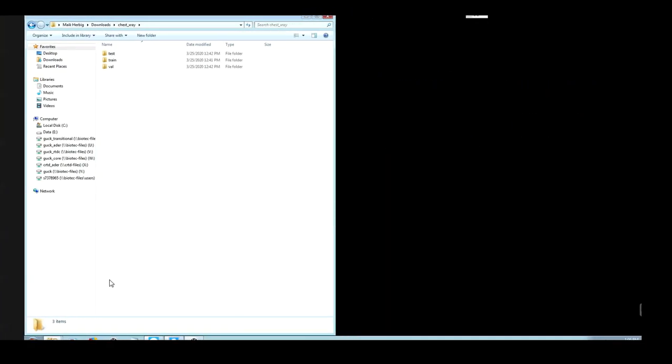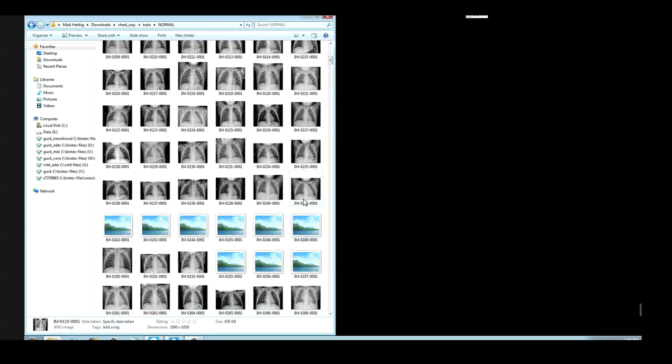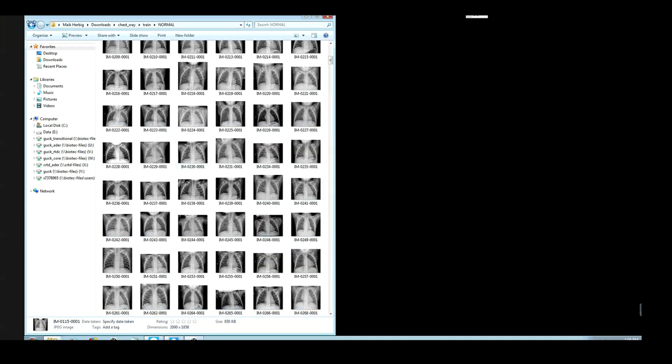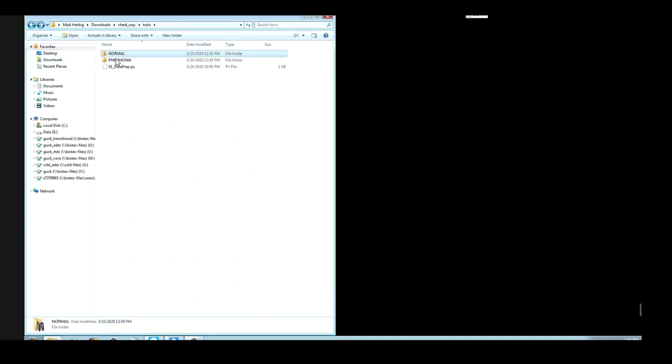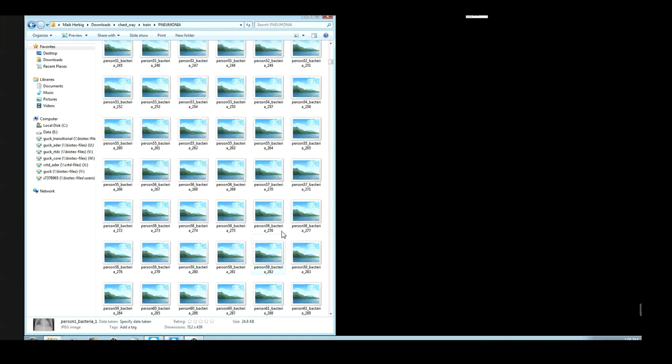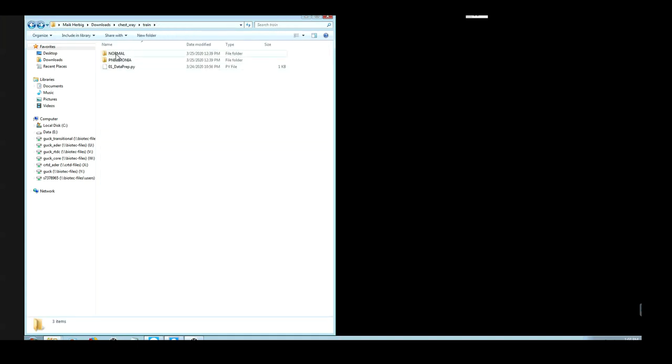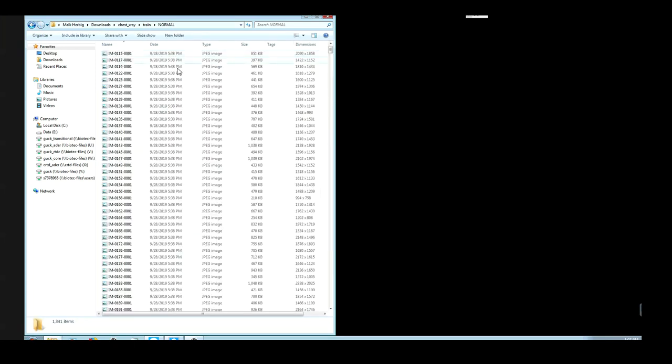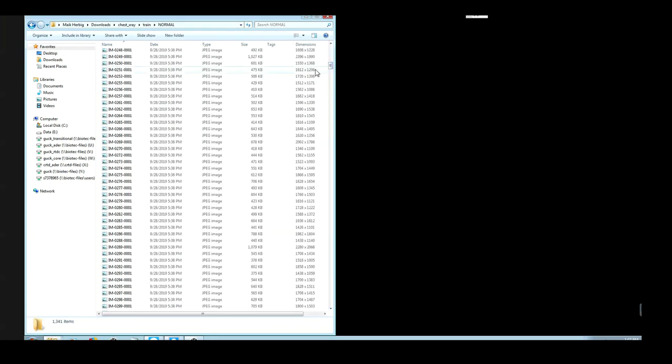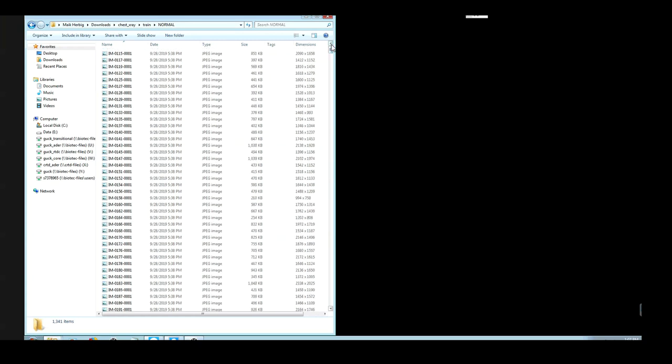Once the download finished and you unzipped, you will find a folder with these contents. First, there is a training folder containing a folder with images of healthy normal patients and a second folder with X-ray images of pneumonia patients. Again, all these images have different dimensions. So first of all, I would like to resize these images.